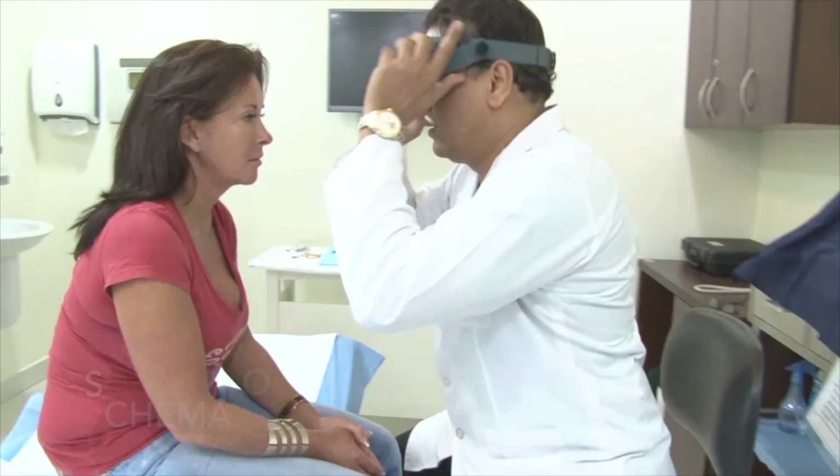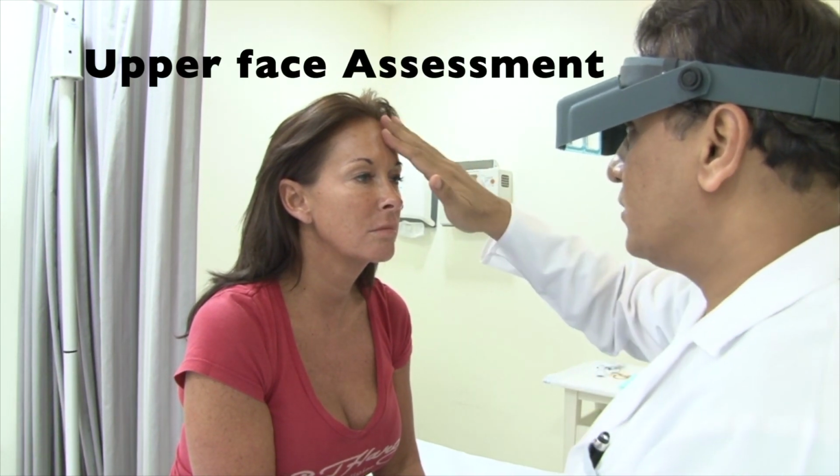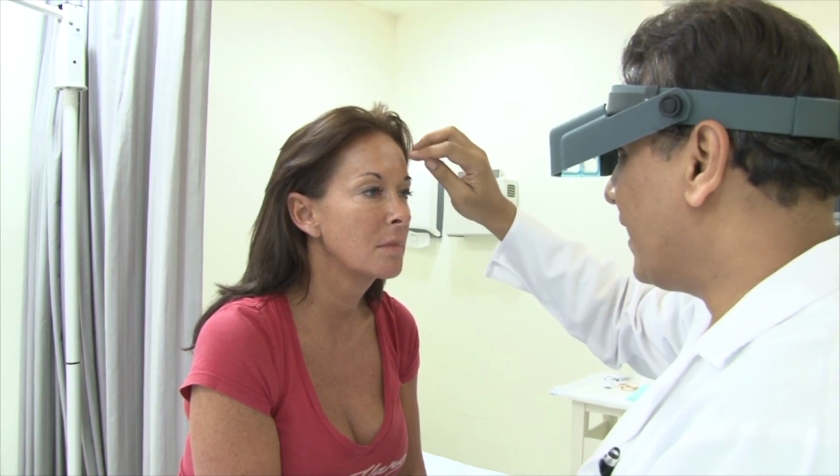Okay. Well, we'll start with the top part of the face. If you see, your brow is pretty good. The forehead doesn't show some static lines in this position, and this is very strange actually. Normally we get lines horizontally. Now these are probably because of the way you sleep. We had this conversation before. Is there anything you can do to get rid of these?